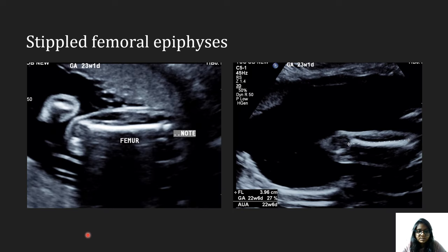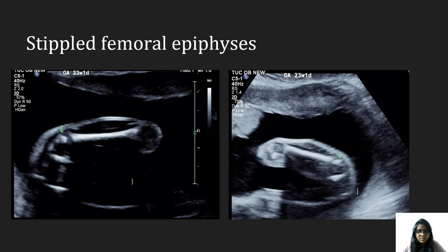Here we can see the stippling of the femoral epiphysis. The green arrows are representing stippling of the femoral epiphysis. Stippling means focal bony calcifications which appear dot-like.